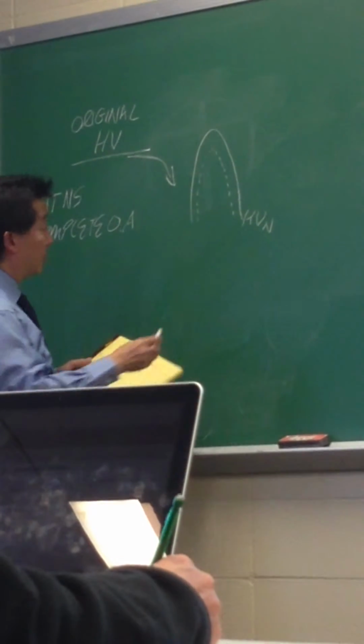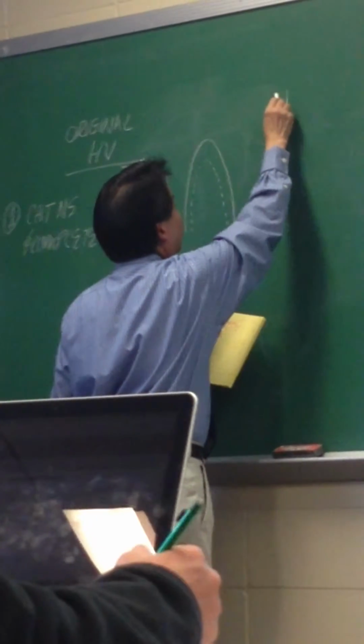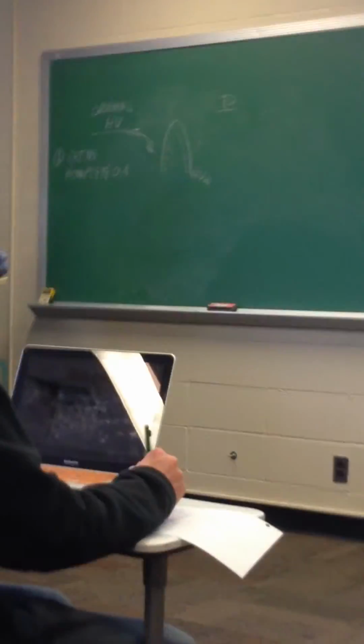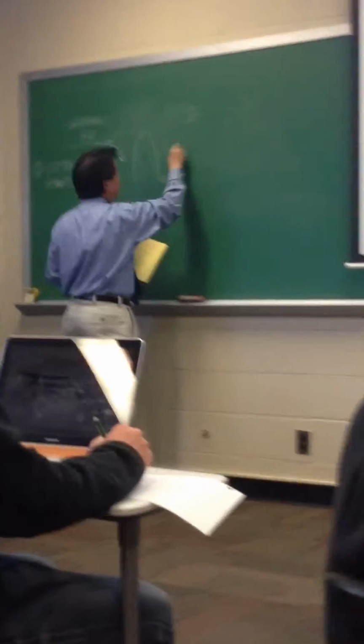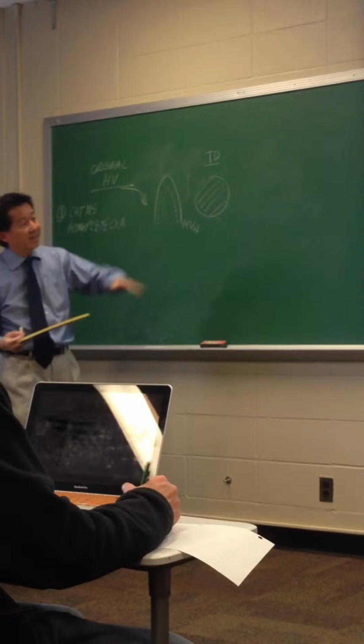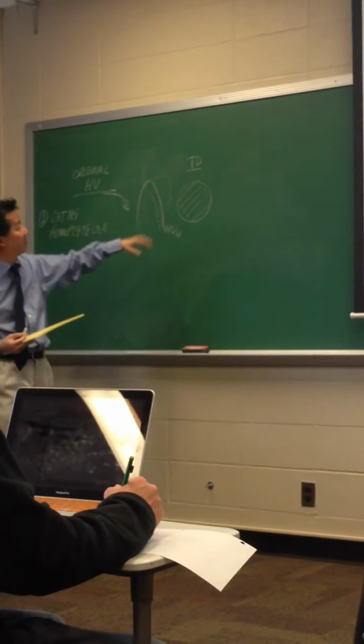Okay. So what would happen here is your total deviation plot, which is that first one. All that does is compare stats, right? Normal to abnormal. And so you basically get loss. Instead of that half hemifield, you get the whole thing lost there.